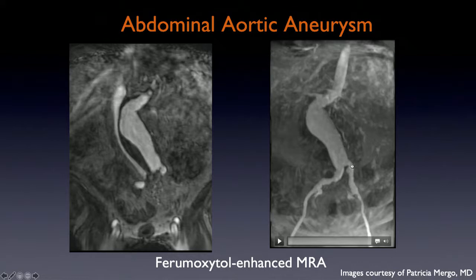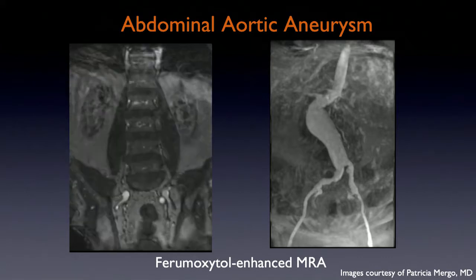The advantage over non-contrast approaches for aneurysms like this is that you can do all the same aneurysm planning that you can with a CT study with MR. The challenge is that you don't have the calcifications that you would easily see with CT, and that can be brought into play by doing fused imaging, and I have a couple examples of that from Paul Finn.